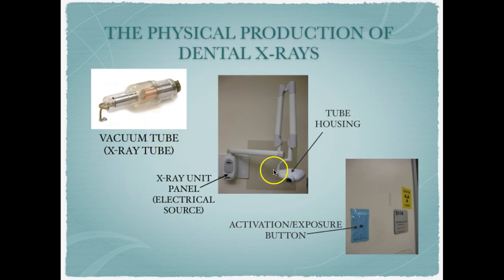So think of our dental X-ray unit like you do your TV. You leave a TV, you leave your stereo, you leave your computer plugged in most of the time into the outlet in the wall. So there is a source of electricity. However, nothing happens until we actually, for our TVs, hit a remote or have voice command. So nothing actually happens until it's activated. And the same thing with dental X-rays and our dental unit.